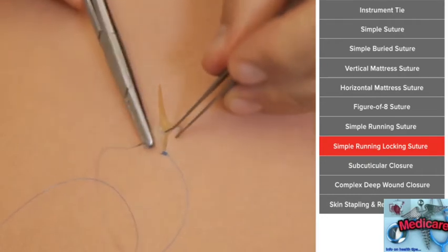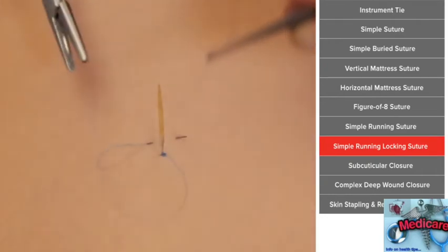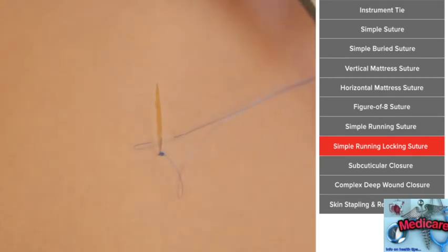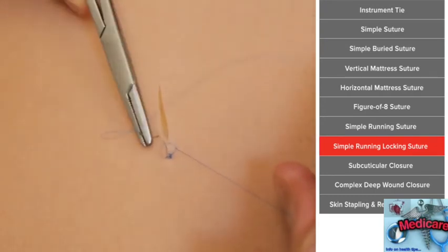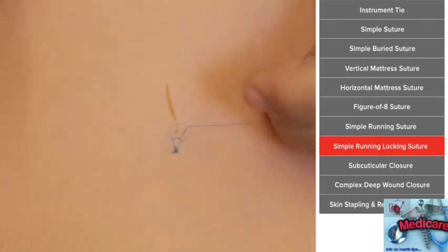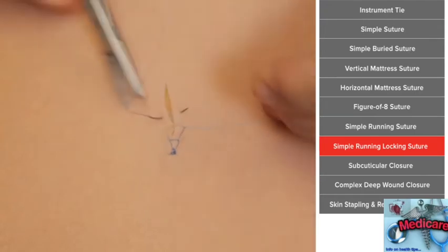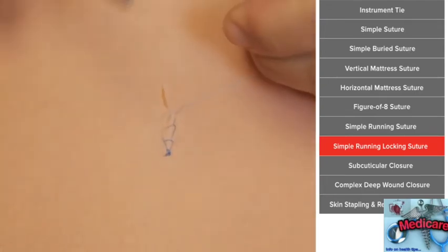What I mean by that is you take your simple bite, and now before you pull it completely through, you take the needle and pass it through the loop. So now it's like a little pulley that closes down and locks it down. Then you take your next stitch and make sure it comes back through the loop. So you can do a pretty long suture line and not worry about it untying behind you as you go.